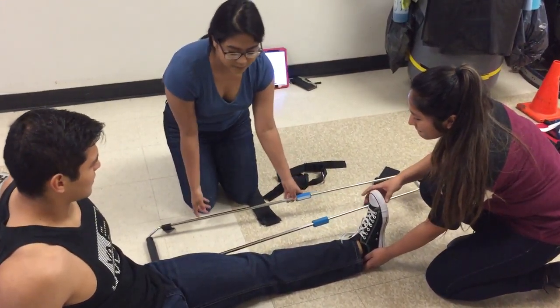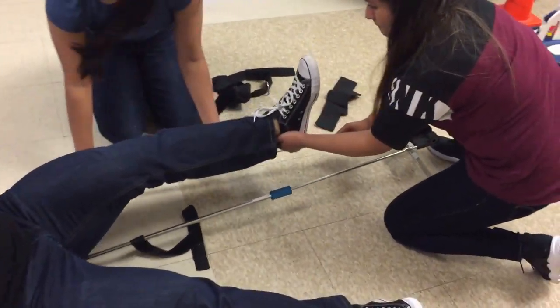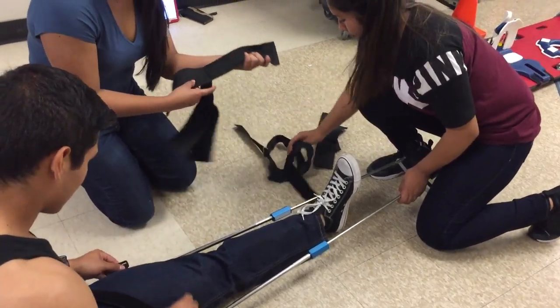We're going to measure the splint and then apply it above and below the injury. And then we're going to apply the straps on.